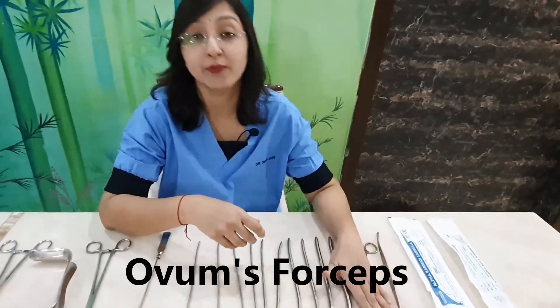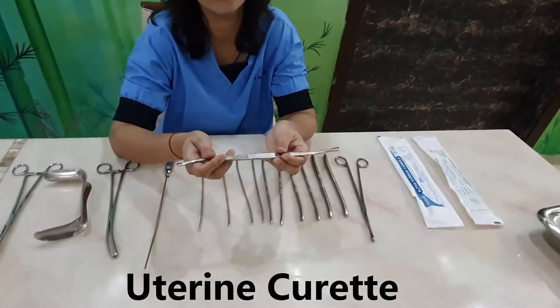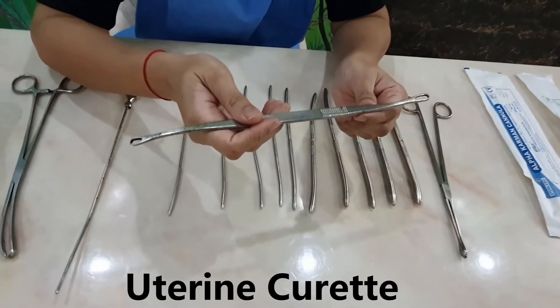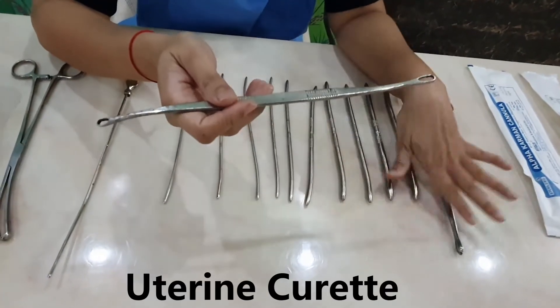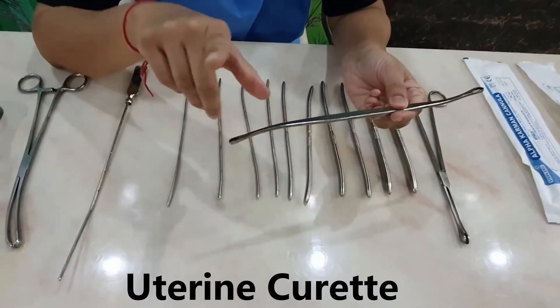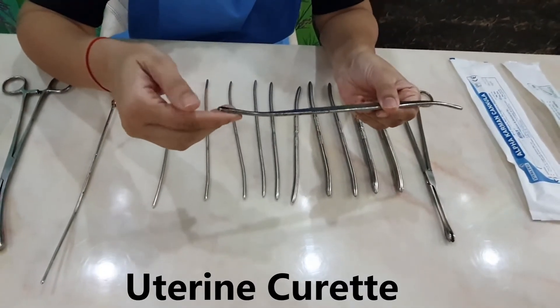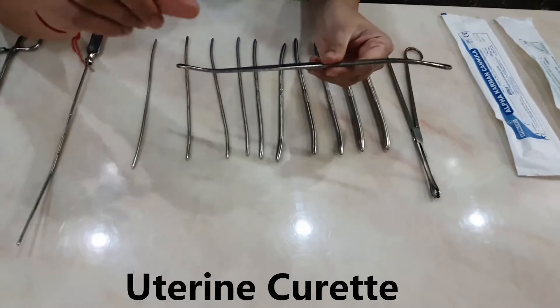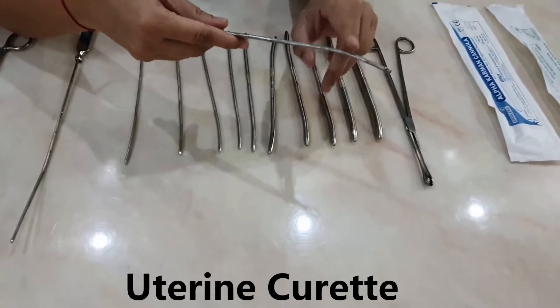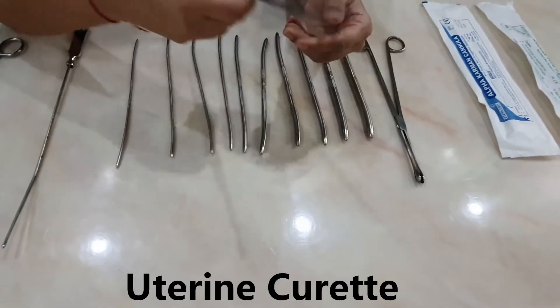After the ovum forceps, we use the uterine curette. If we are doing an endometrial biopsy for gynecological purposes — to determine the cause of uterine bleeding — the ovum forceps is not used and we go directly to the uterine curette. The curette may be sharp at both ends or have one sharp and one blunt end. The sharp end is used in gynecological procedures when the uterus is relatively firm; the blunt end is used for obstetric purposes when the uterus is soft. With this curette, we curette the uterine cavity.